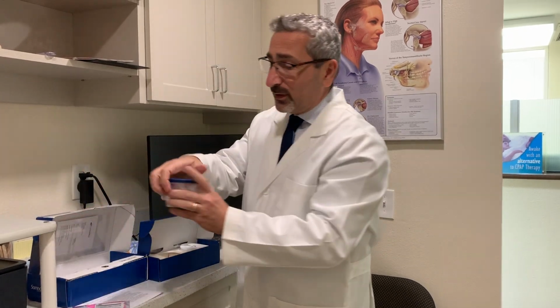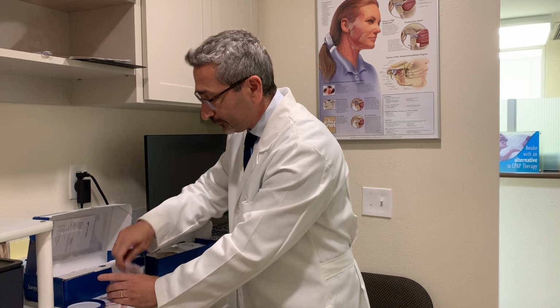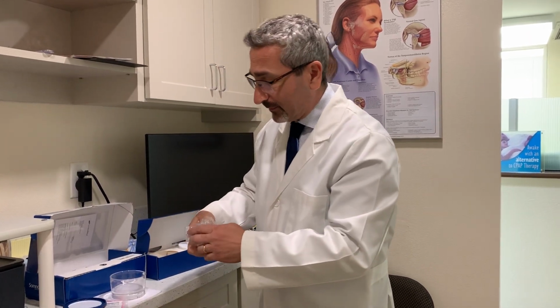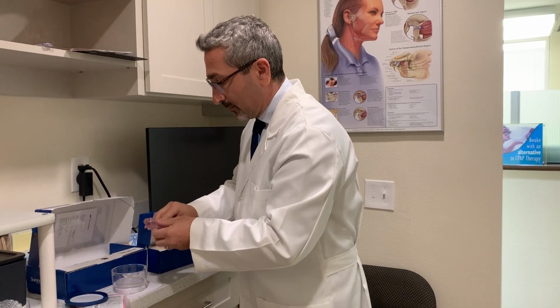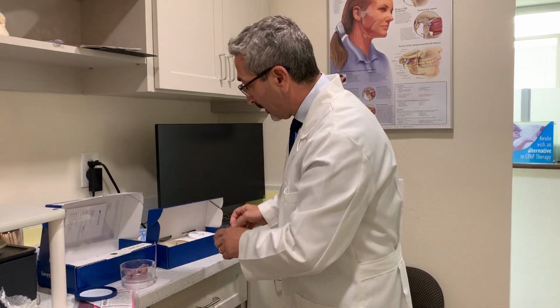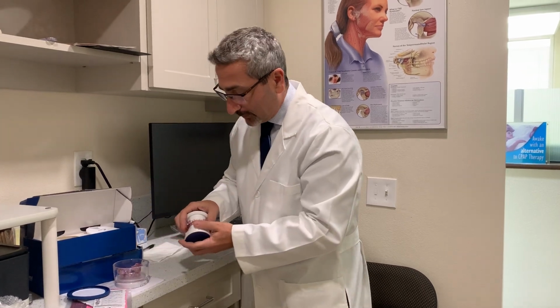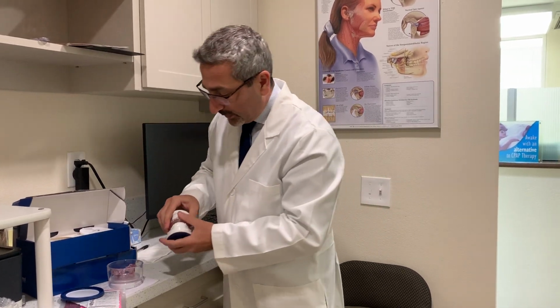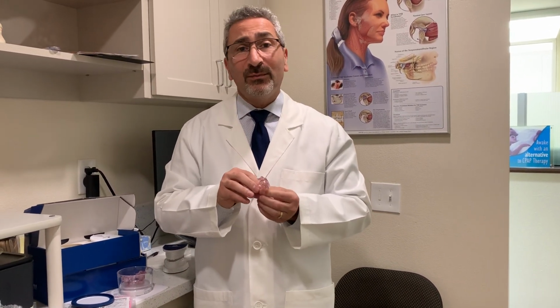So now what you're going to do is you're going to open the lid and take out your mouthpiece. Okay, I'm going to pull out my sample here. So what you're going to do is, I want you to put in your mouthpiece 30 minutes to an hour before going to bed for the first week and sleeping through the night with it.